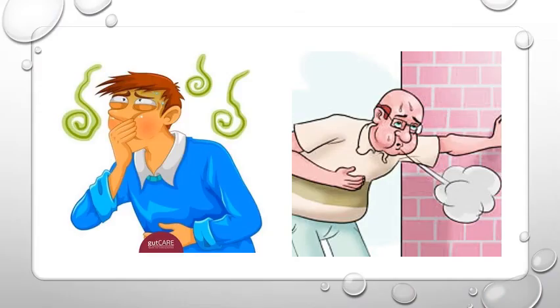If nausea or cramping occurs during a feeding, the feeding may be entering the stomach too fast. Contact the delegating nurse or follow instructions from the delegating nurse to slow down the flow. For a bolus feeding, lower the syringe. For an intermittent or continuous feeding, slow the pump administration flow rate.